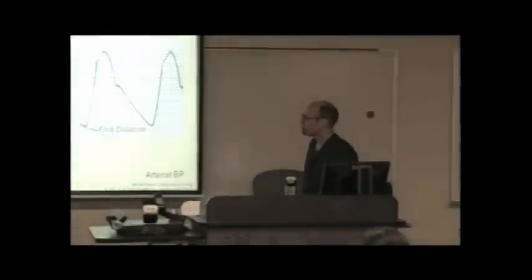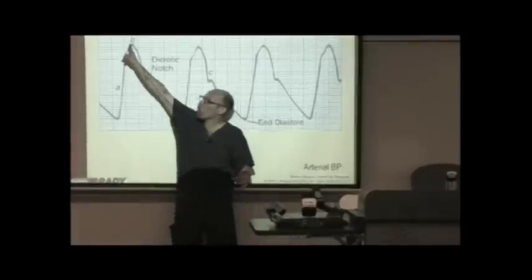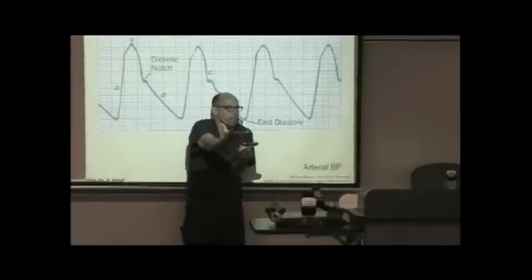Okay? People think, oh, diastole starts when the waveform starts to go down. No. The heart is just squeezing. There's no more blood left in the ventricle, so the pressure starts to go down, but it's still squeezing. There's just not enough blood left in it to generate the same pressure.